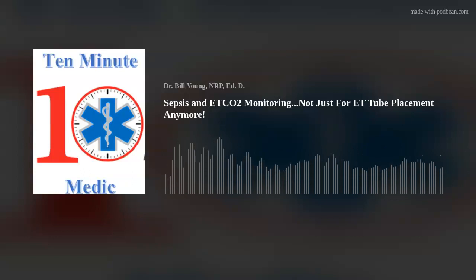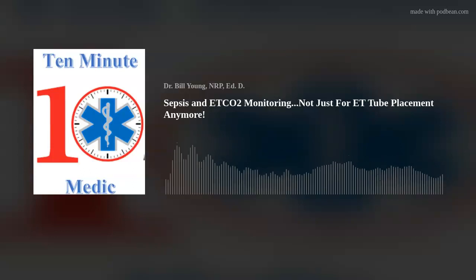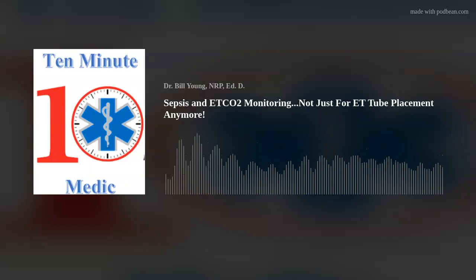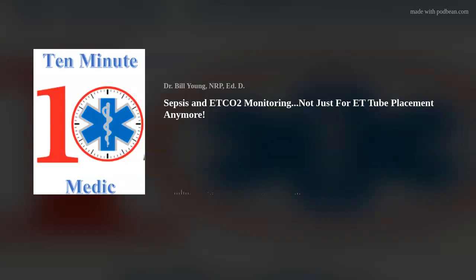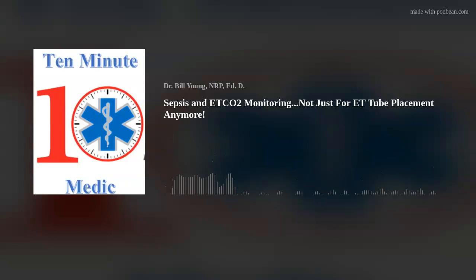Deviations from this range can have significant physiological implications. These include hypocapnia, or low end-tidal CO2 levels. Values below 35 may indicate hyperventilation, often seen in cases of respiratory distress, pain, anxiety, or head injury. It can also be a sign of a reduced cardiac output or a hypoperfusion state like shock. This is an indication that CO2 is being blown off at an excessive rate.